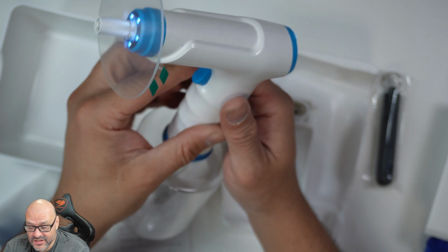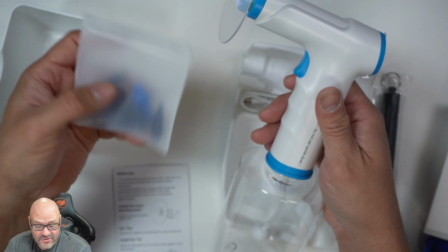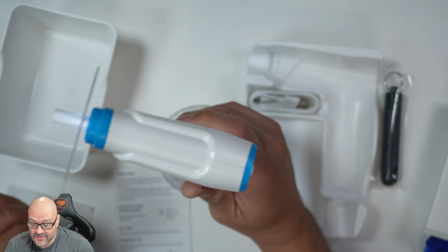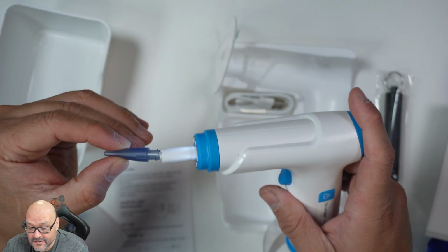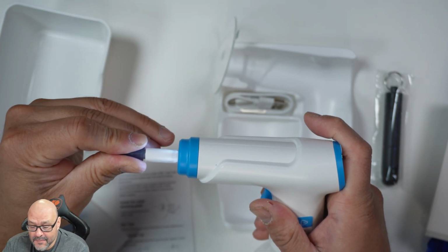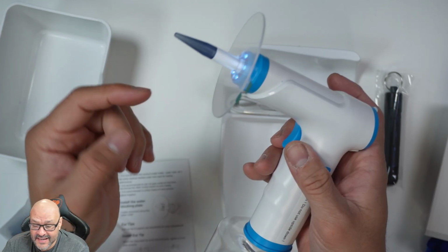And then all you gotta do is just put in the nozzle and set it up and use the actual nozzle. So when you're using the nozzle, let's go ahead and open one up. All right, we're gonna select one nozzle right now. You guys can see that. You just point it in there and push it back in there, and that's pretty much it. Locks it in place. Now this part right here, it's a plastic.